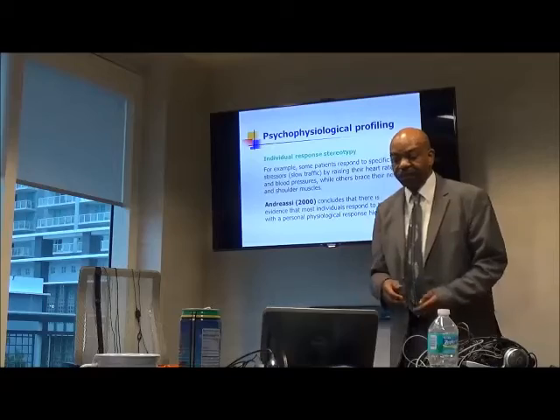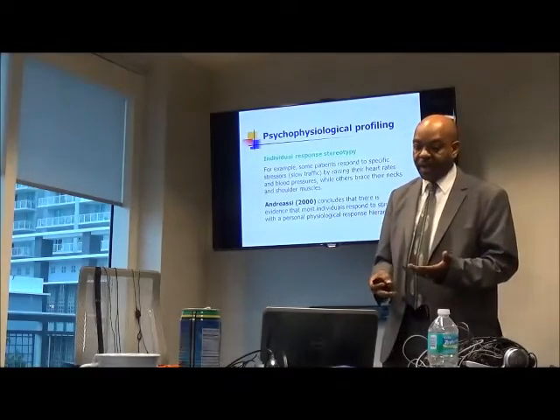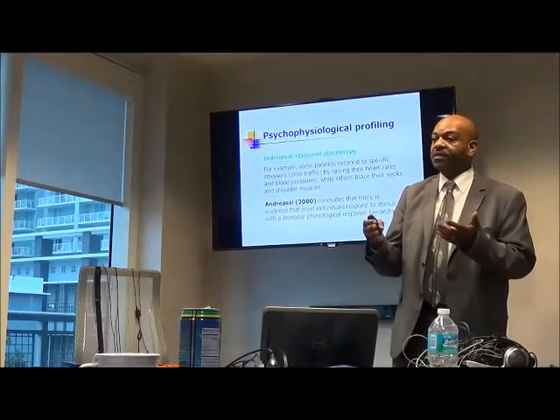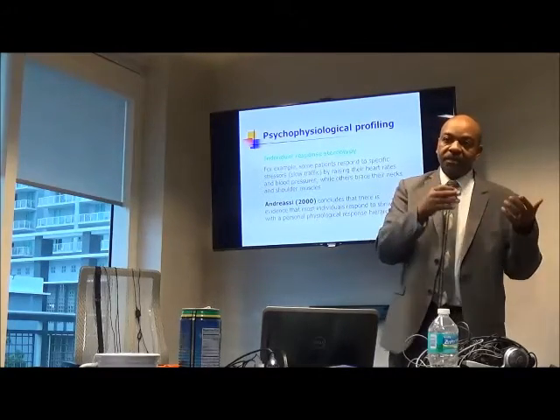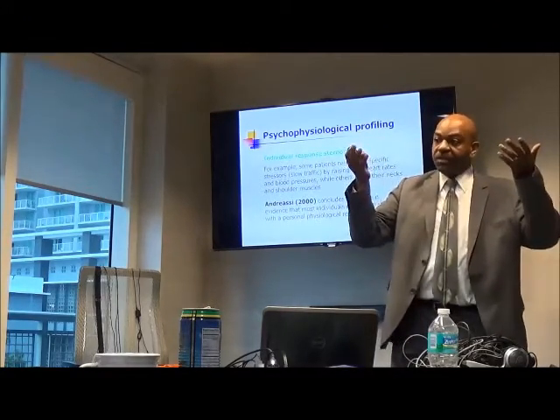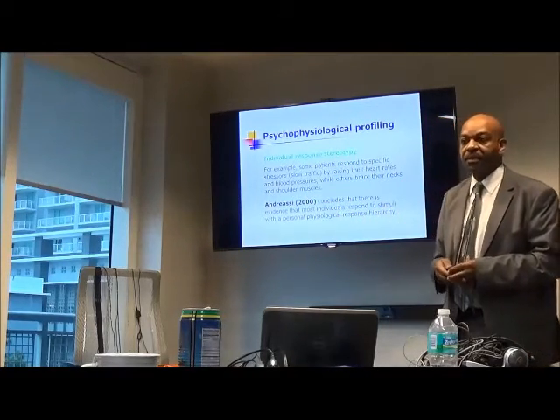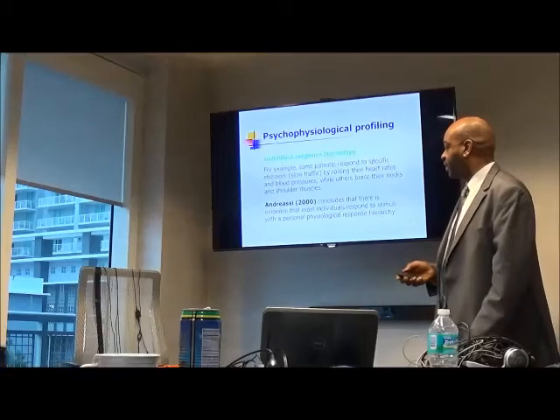It's different for different people, and you may have a person who may respond first with one modality, and then if the stress continues or elevates, then the other modalities might also respond. So you can start to see some of those things.